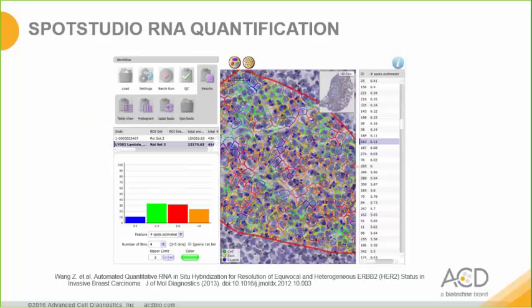This is an example of SPOTSTUDIO image analysis for HER2 and breast carcinoma via RNAscope. A region of interest has been manually drawn, demarcated by this thick red line. The software picks up cell nuclei based on hematoxylin staining and then identifies cell boundaries through approximation of average distances between the cell nuclei. Dots are detected based on pixel color. Single dots are outlined in yellow, while clusters are outlined in dark blue. The algorithm then counts dots within each cell and bins and outlines each individual cell by color based on the number of previously established categories or bins.